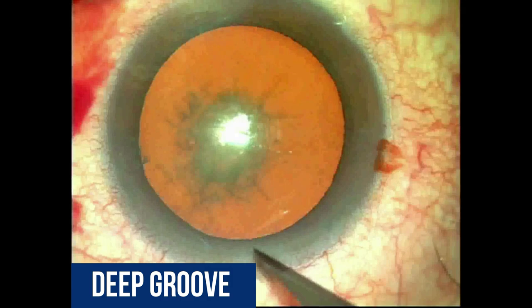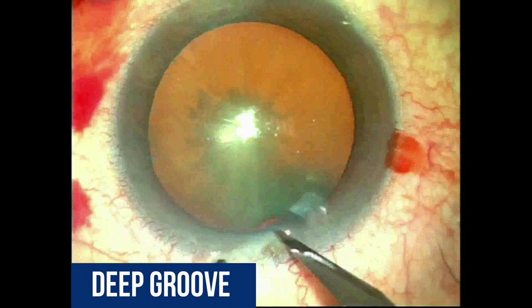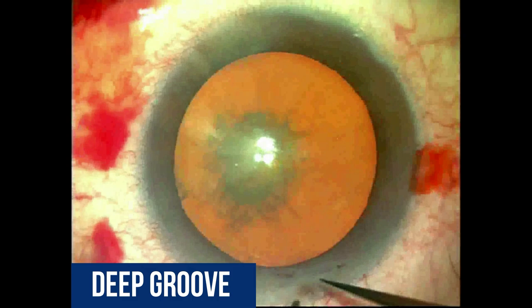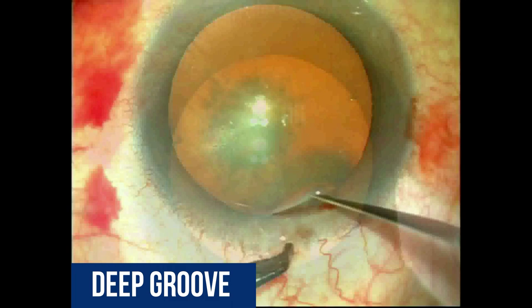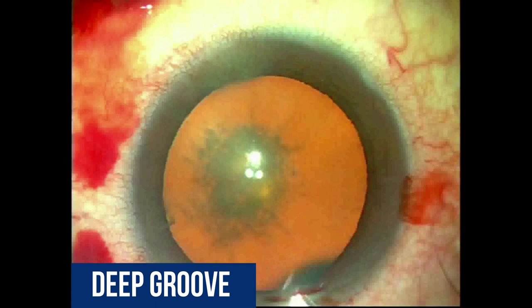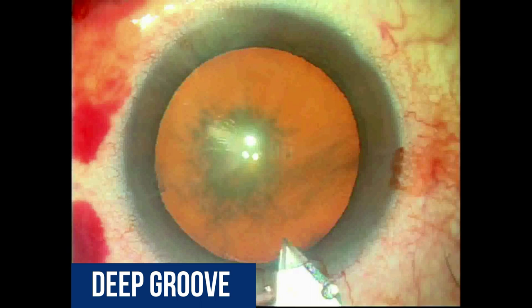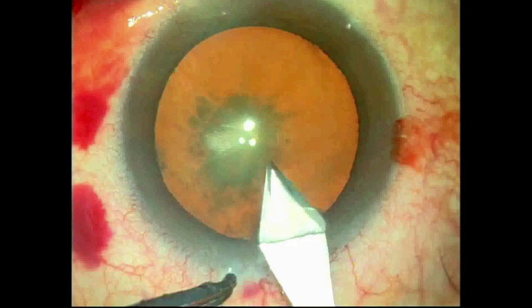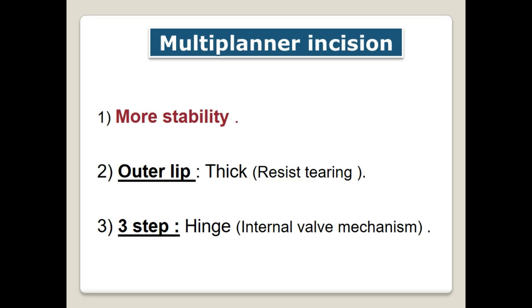The three-step, deep groove, or tri-planar incision involves a deep vertical groove of 80 to 90 percent of corneal thickness, and the keratome passes through the middle of this groove to create the tangential element of the incision before entry into the anterior chamber. The rationale is to create a hinge that can resist deformation from external pressure — so this incision is called a hinged incision. To conclude, a watertight incision should be multi-planar, with the external wound either grooved or beveled.